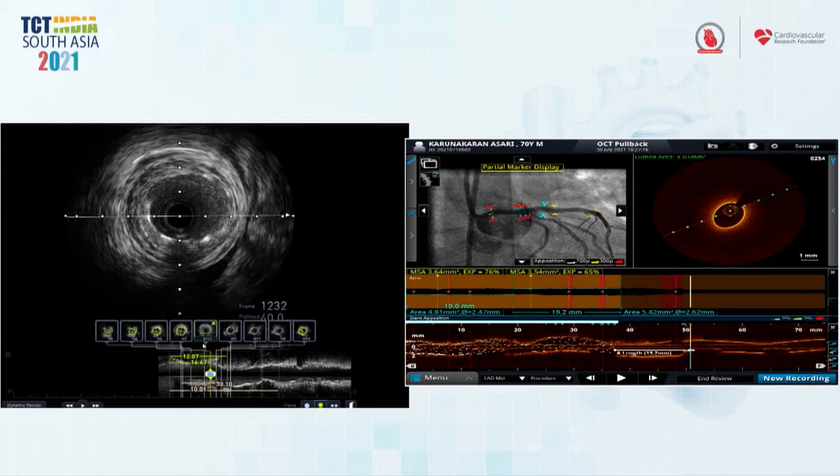So what we're going to do is take, I don't know whether we need a 3.5 stent. What do we have in Onyx 3.5? Okay, so we will use an 18 Onyx. That's the one we have here. So we maybe have to push in a bit into the ostium. I understand, that's a reality. If you have an 18 millimeter stent, it's better to just overlap and make sure that you don't miss in either direction. Yes, that's right. So we'll get a 3.5 by 18 Onyx, and then we'll show you an OCT after that. So let's get the stent in, please.